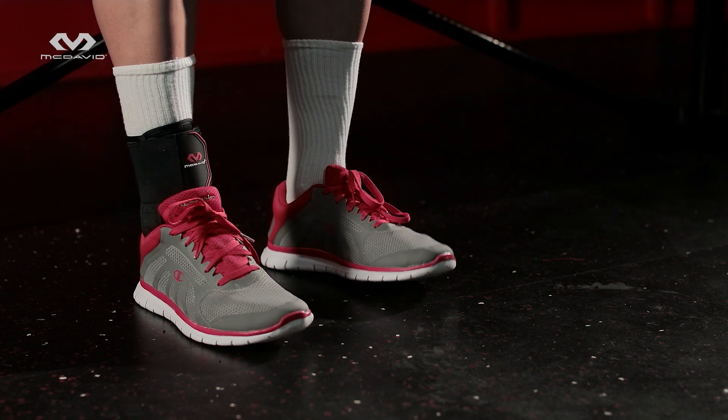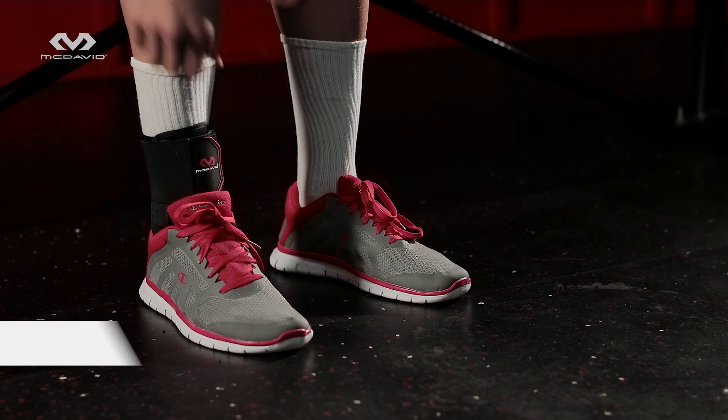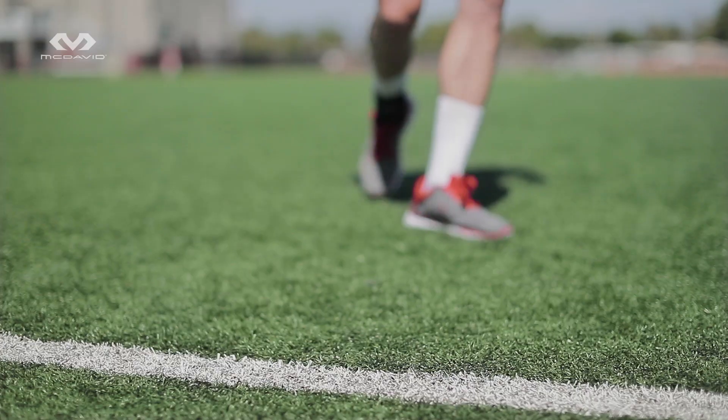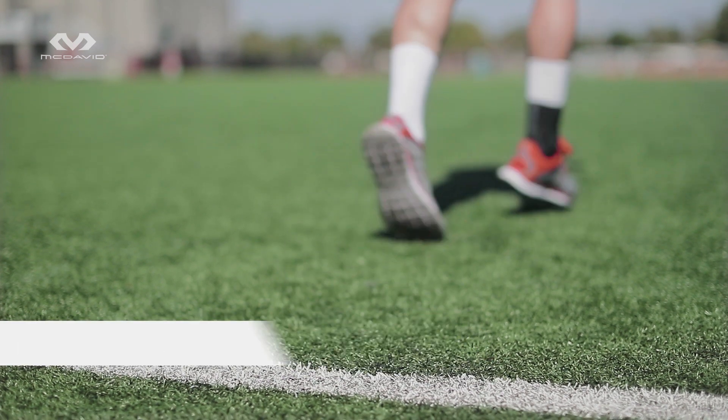Fit should feel very snug and comfortable, but not so tight that it's cramped. During extended use, be sure to recheck position and tension and adjust if needed. Extensive research and testing proves you are three times less likely to injure your ankle when wearing a McDavid 195.